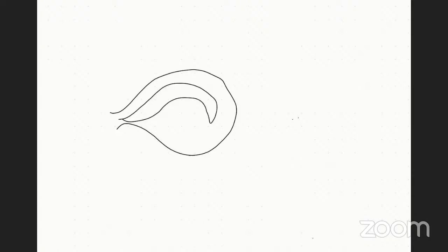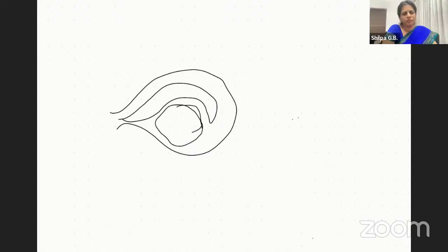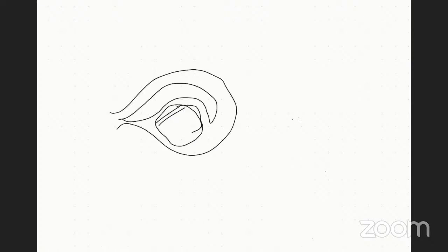See, this is the uterus. This is our adenomyotic uterus, madam, and the endometrium is like this, the curved endometrium which we have. And the adenomyosis is going to be somewhere here. This is our adenomyosis. So when I look at it from the point of view of getting this done, it got erased. No, it's here only. Sorry.